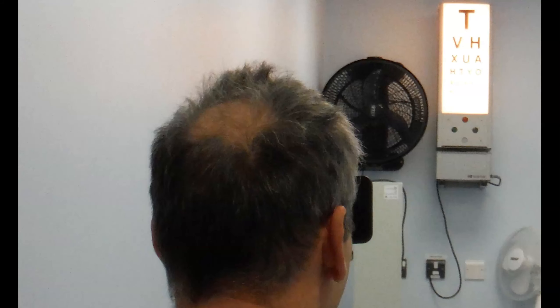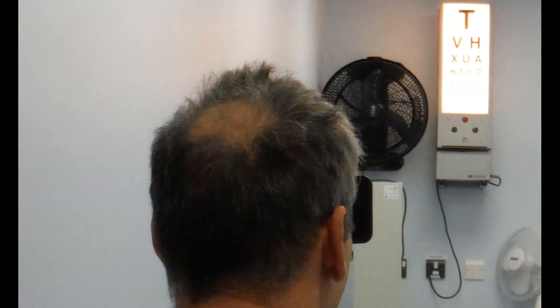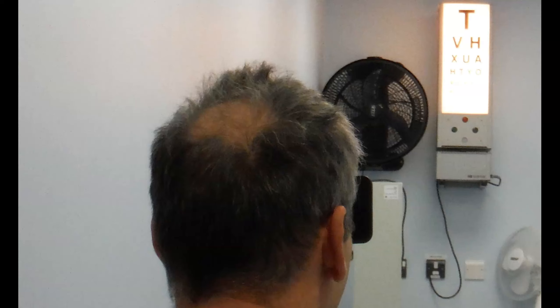Here is a patient whose right eye is being tested for visual acuity. You can see that the left eye is completely occluded with this proprietary occluder, but a piece of card is equally effective for this purpose. The patient can hold the occluder himself and sits at 6 meters or 20 feet from a Snellen chart, and is instructed to read as far down the chart as he possibly can. You should use gentle encouragement to really test them to the limits of their ability to see.